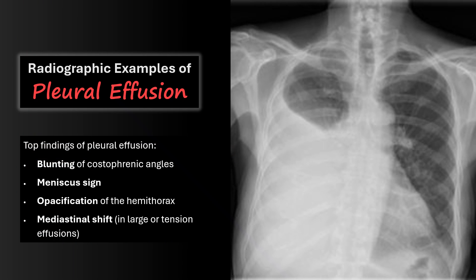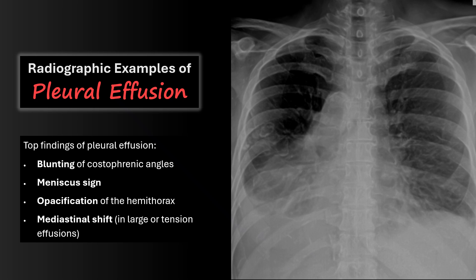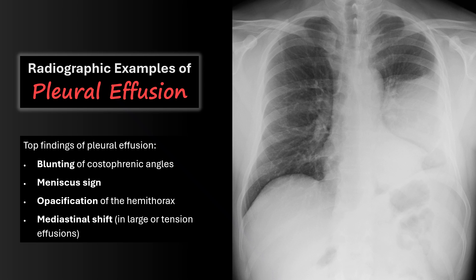Let's look at a few more examples. In the right middle and lower lung field you can see a large opacification and blunting of the costophrenic angle with the meniscus sign. Here's another example showing poor visualization of the left costophrenic angle due to pleural effusion. And one more — in the left lung field you can see poor visualization of the left costophrenic angle and opacification of the lower lung field.